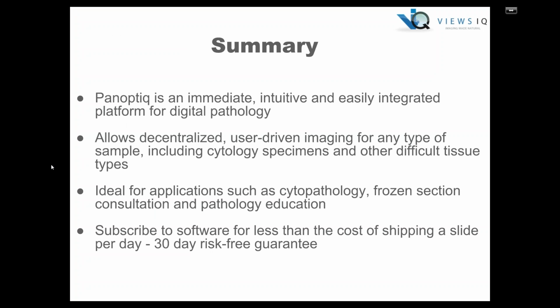To summarize the presentation, Panoptic is a new, intuitive, easily integrated platform for digital pathology. It allows decentralized and user-initiated imaging for types of samples that include cytology, hematology, microbiology, and other difficult tissue types. It's also ideal for applications such as cytopathology, frozen section consultation, and pathology education.